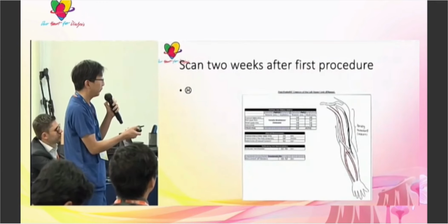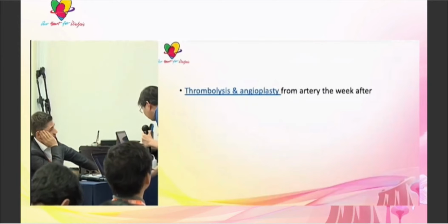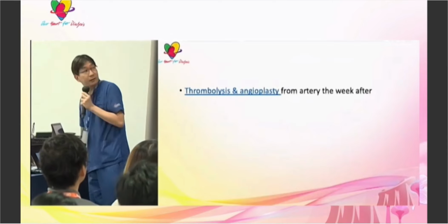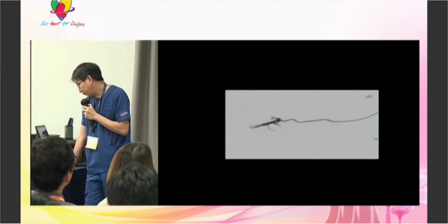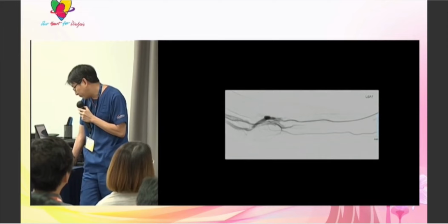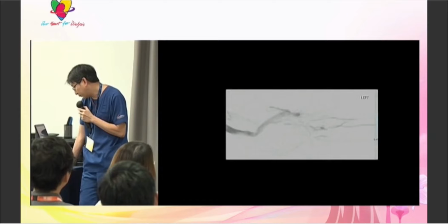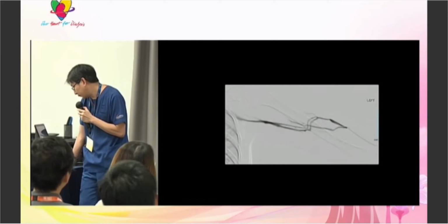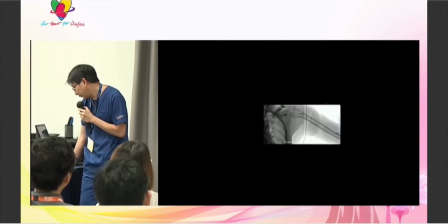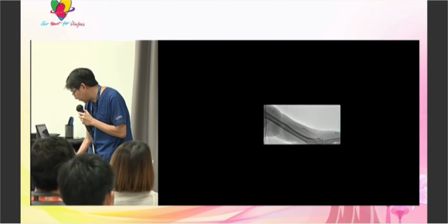You think it's time to give up, but I came back and did a thrombolysis from the artery. So I got the thrombolysis pictures. Can we switch? Oh, you've done it. Thanks. So coming up the radial artery, that's showing that everything's going down the basilic. That's the stump of the cephalic there. So eventually managed to cross into it, thrombolyzed it. This is lacing with urokinase. I thought it'd be able to go faster.